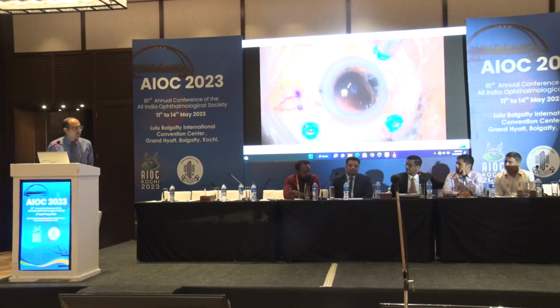At the end of the day, a patient would have been advised cataract surgery, there is some complication, and the patient would have come to the VR surgeon the same day. We would have to achieve at least a reasonable refractive outcome. So I stopped doing the tunnel thing, and that solves a lot of problems.